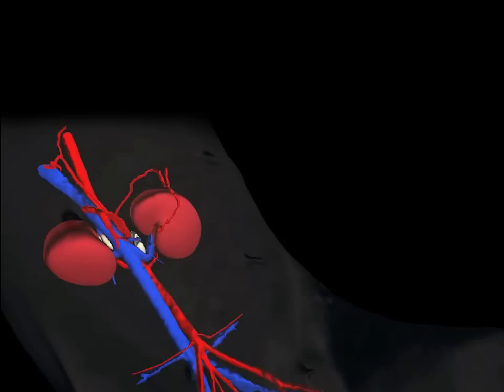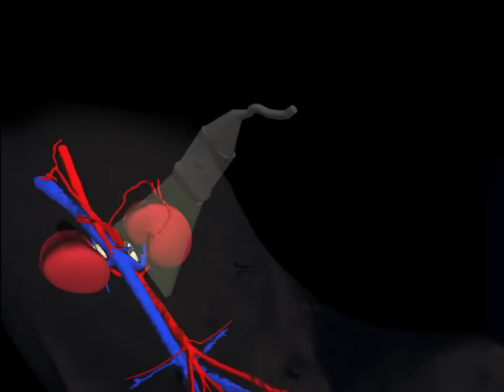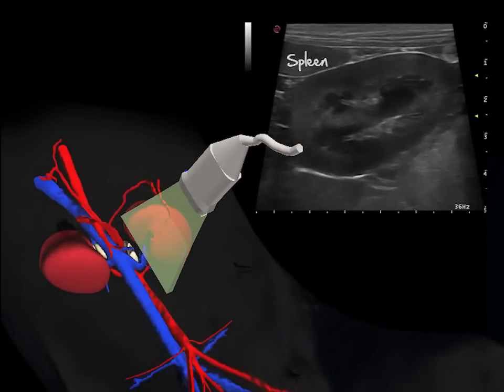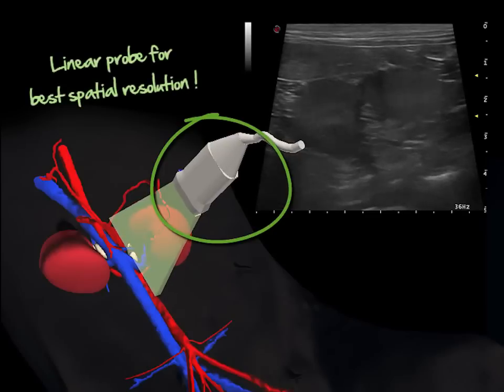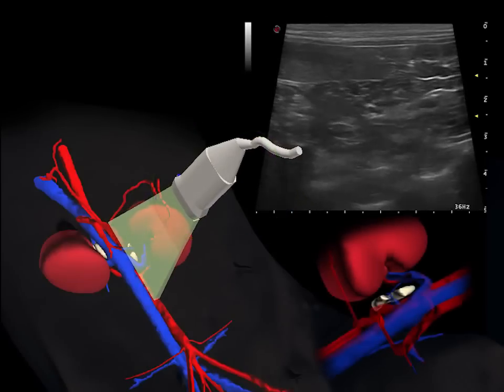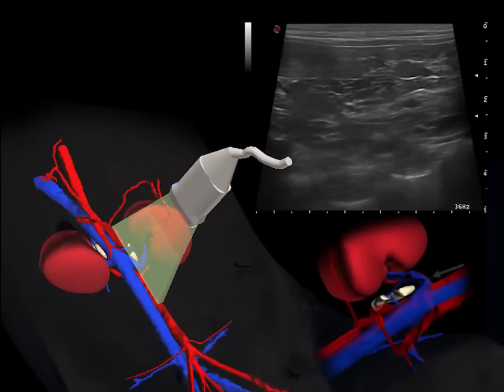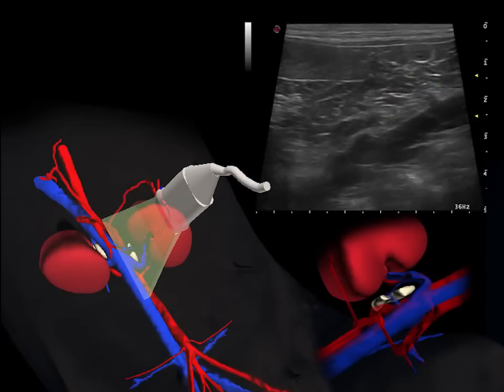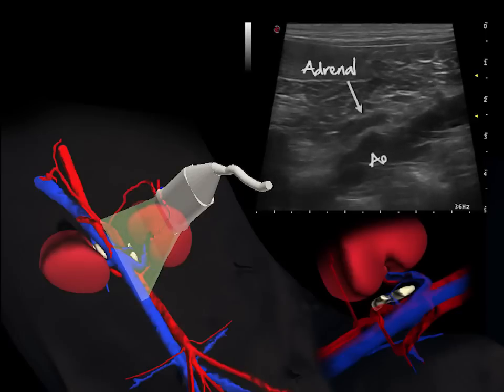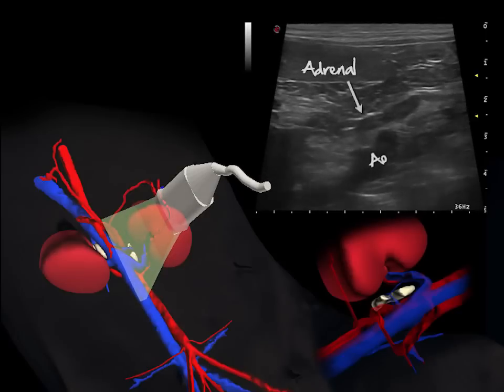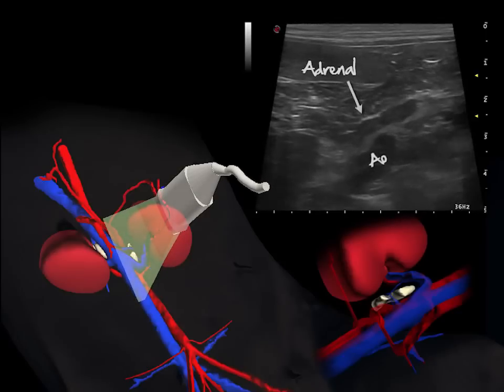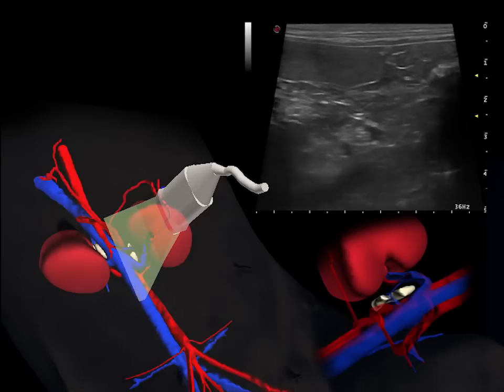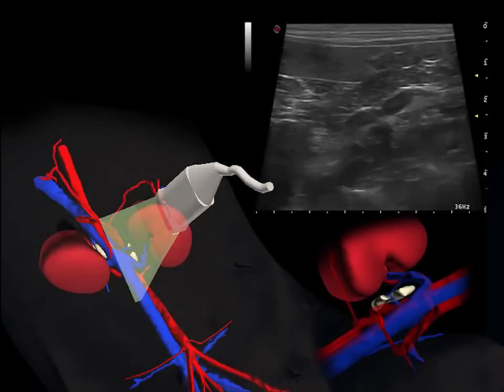When the surface of the abdomen is flat enough and the patient tolerates gentle pressure of the probe so that the adrenal becomes only a few centimeters deep, a linear probe is the best choice to obtain images with the best spatial resolution. From a longitudinal plane of the kidney, the renal artery and vein are scanned as you move medially toward the aorta. Observe the characteristic shape of the adrenal — it looks like a slightly flattened peanut with weak echogenicity, slightly above that of vessels. When in doubt, color Doppler can help differentiate this structure from a vascular lumen.